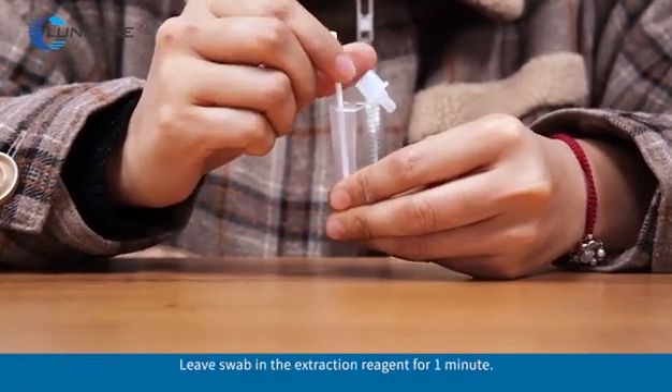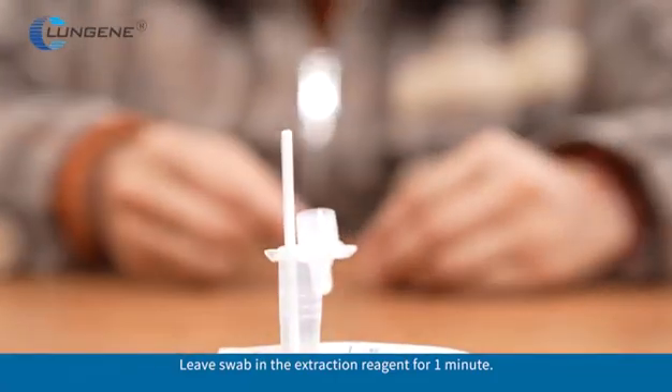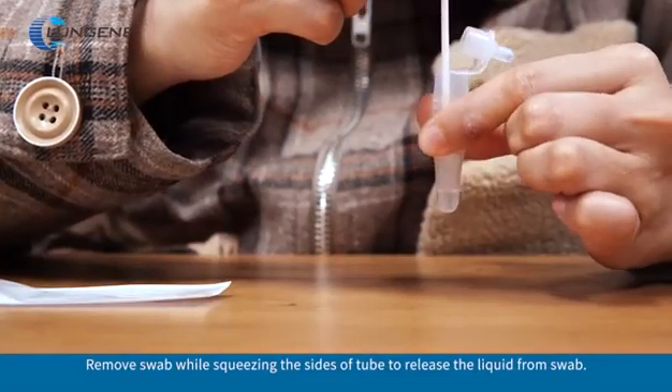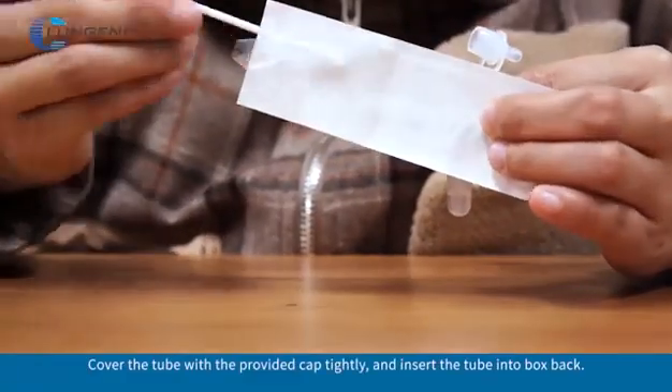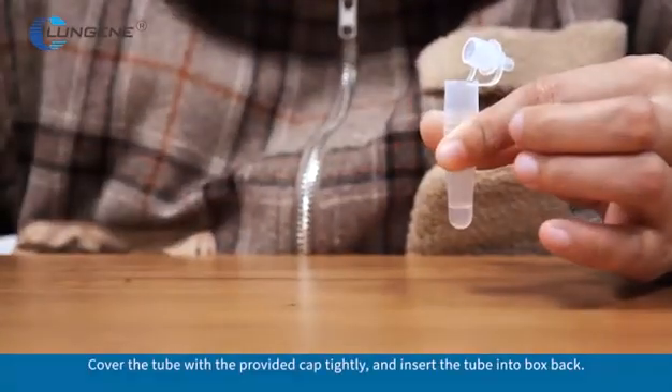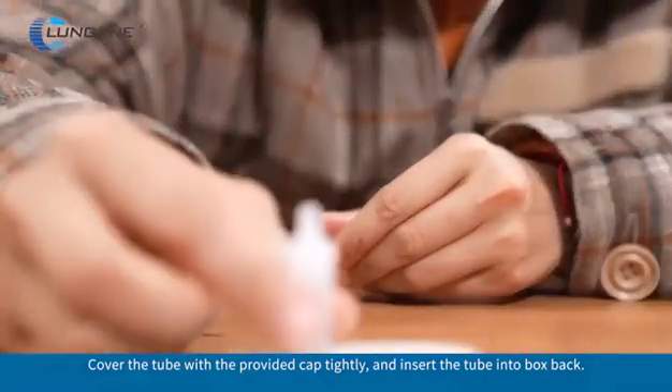Leave the swab in the extraction reagent for 1 minute. Remove the swab while squeezing the sides of the tube to release the liquid from the swab. Cover the tube with the provided cap tightly and insert the tube back into the box.